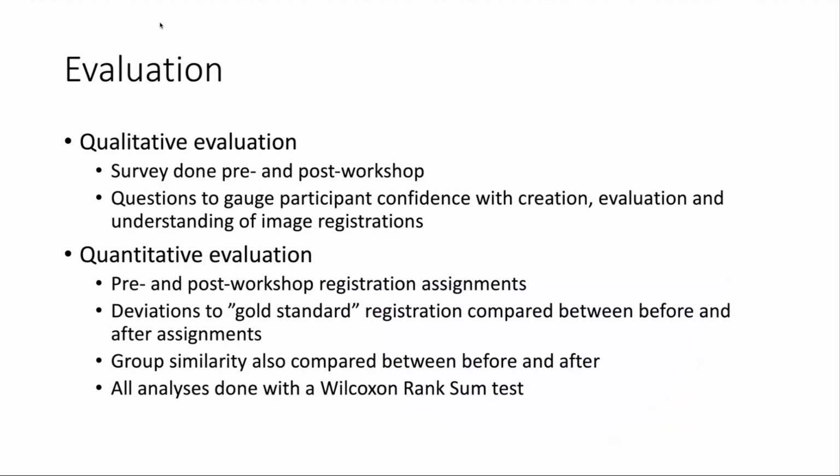Evaluation. The qualitative evaluation we did consisted of a survey each participant completed before and after the entire workshop. The questions were evaluating participant confidence with creation, evaluation, and understanding of image registrations. We also had a quantitative evaluation where we compared participant pre- and post-workshop assignments and measured deviations of participant completed assignments against a gold standard registration, which was actually a previously clinically approved and utilized registration for each case. We also measured each participant assignment's deviations from the group median to measure group similarity for the assignments. And then all the analyses were done with the Wilcoxon rank sum test.